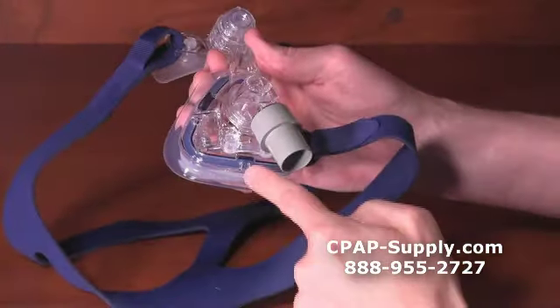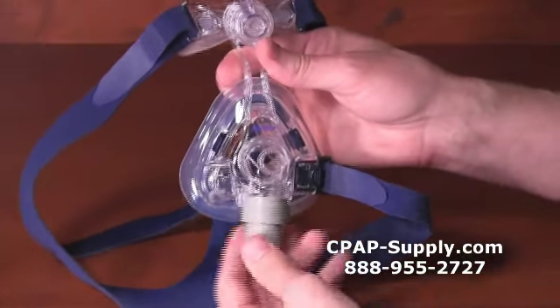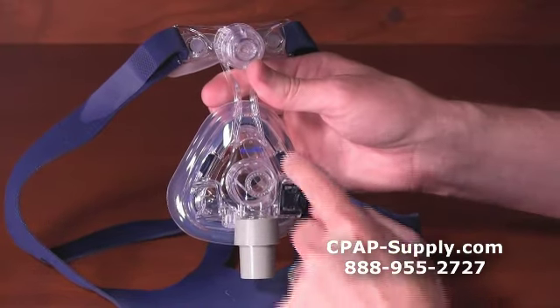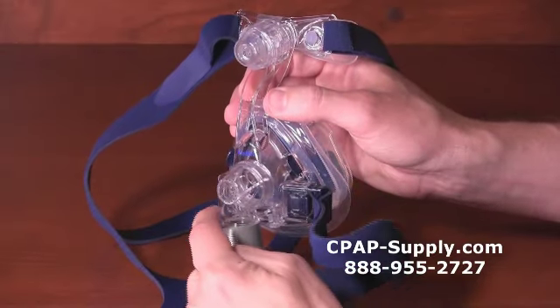Three clicks means the cushion is properly attached. The elbow swivels 360 degrees, and the end of the elbow also swivels to help ensure your tubing doesn't kink. The exhalation vent is designed to be quiet and to direct vented air away from a bed partner.